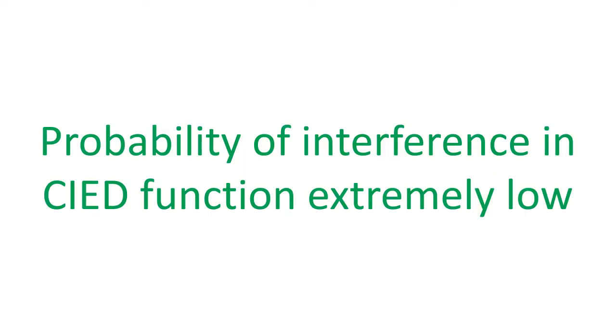US Food and Drug Administration has reviewed the effects of X-ray irradiation from CT imaging on pacemakers and implantable cardioverter defibrillators in 2019. They have made some valuable conclusions on this aspect. As per the US FDA review, the probability of CT X-rays causing clinically significant interference in CIED is extremely low.